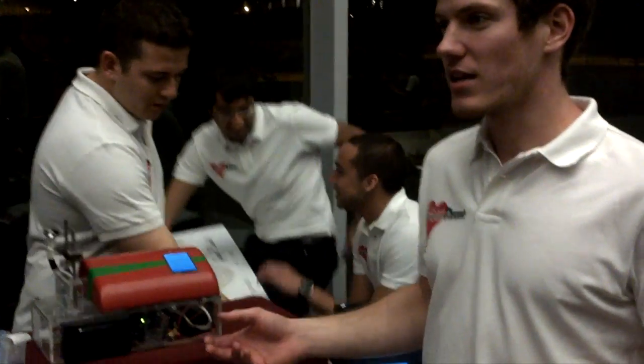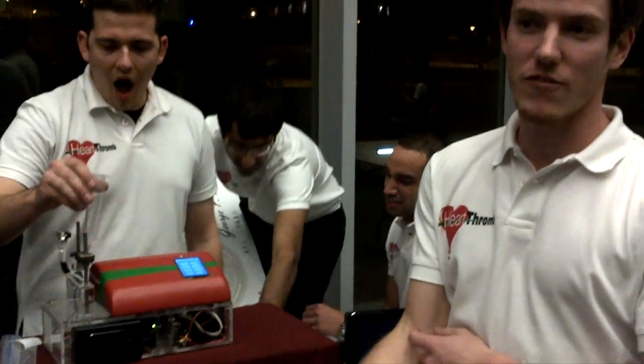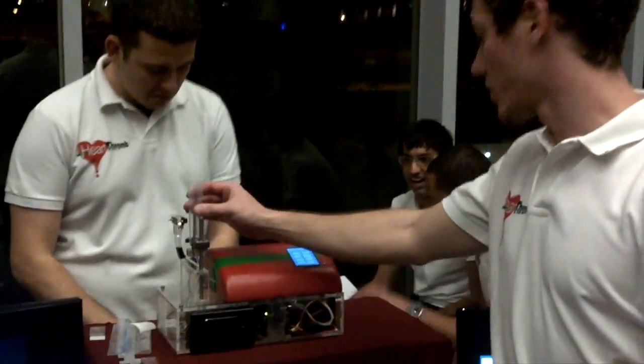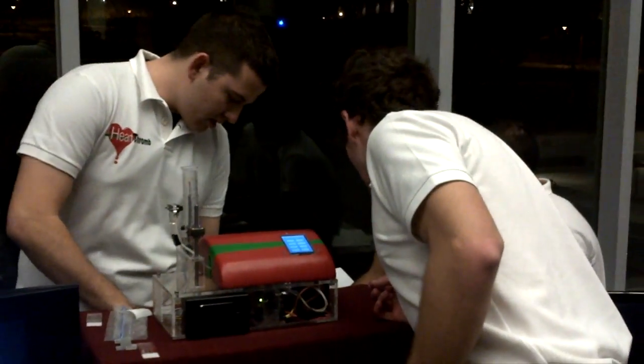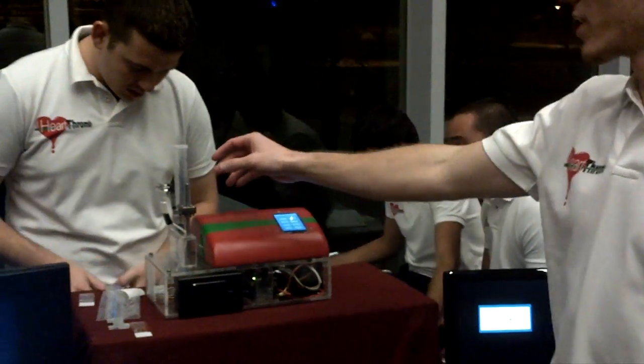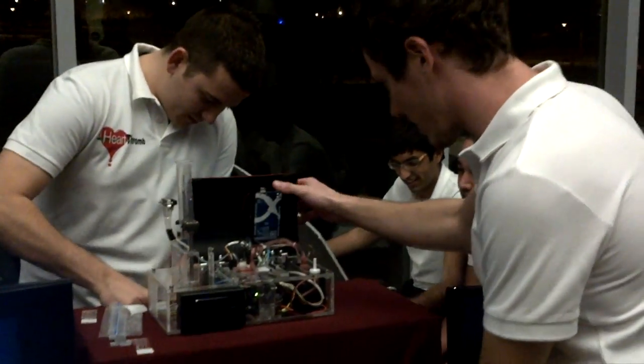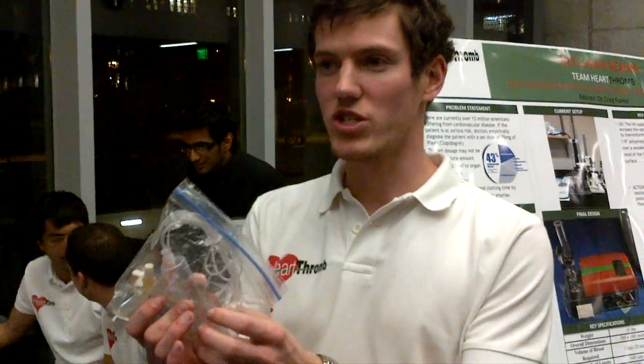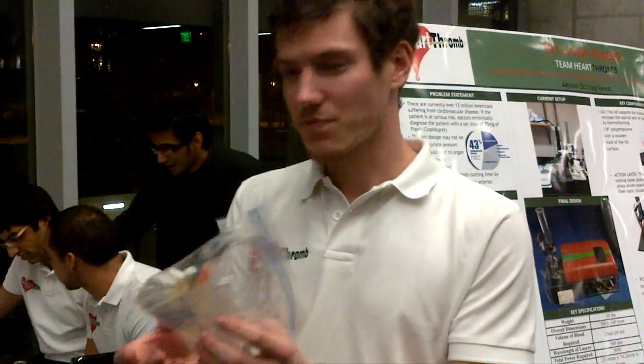So how it works is you take 15 milliliters of the patient's blood, you put it in this syringe, and this whole thing comes in a little pack right here. So this includes a chip, a syringe to put the blood in, and an exit bag.